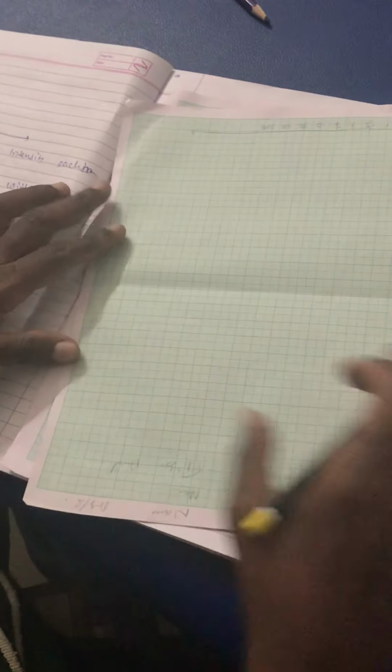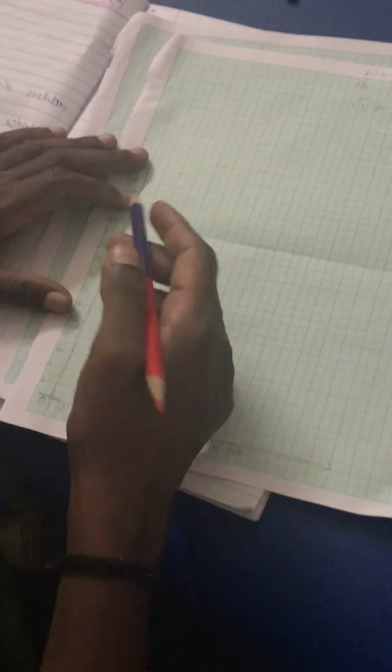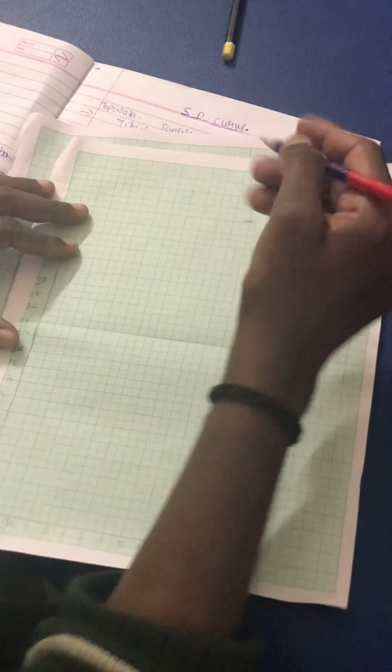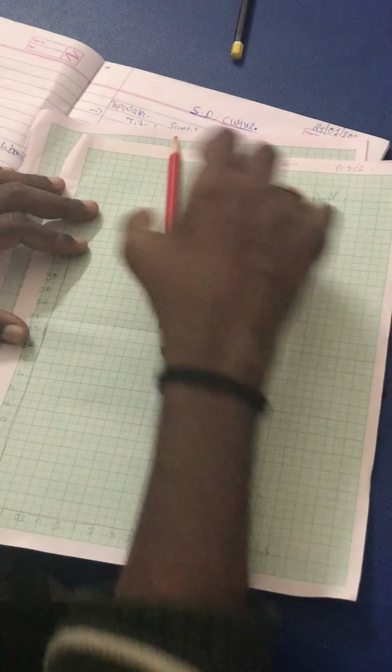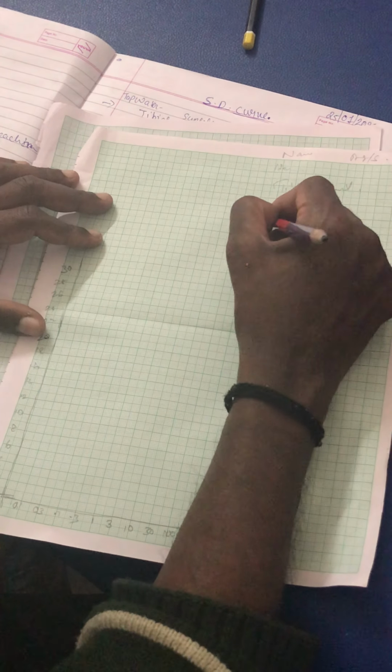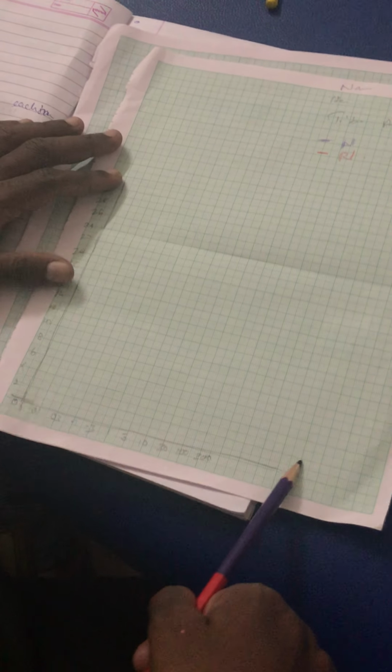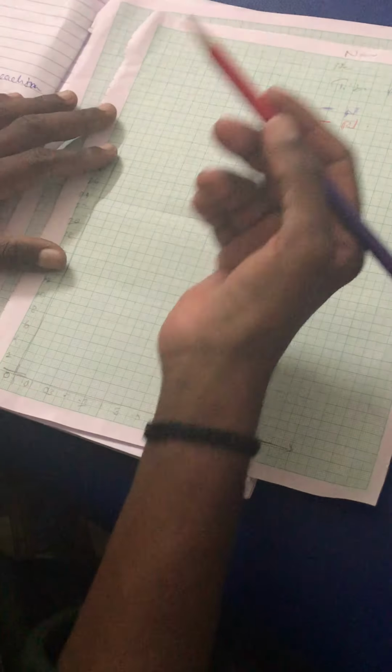Okay, fair enough. Now what I am going to do is this: I said that I'll be plotting a graph. The blue is the normal side, that is the left side, which is unaffected, and the red is the right side, which is affected. Only once will you draw with the blue, and every other time you draw with the red one, because you are going to compare with the normal to see whether it is improving or deteriorating. That's the reason we want two color pencils.